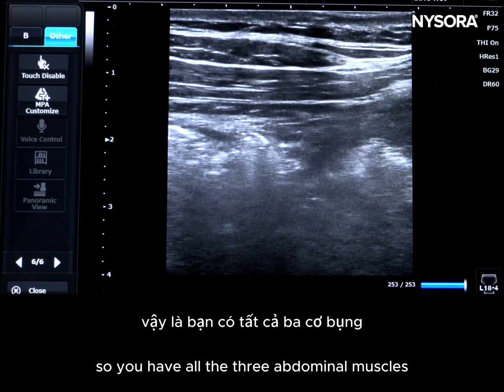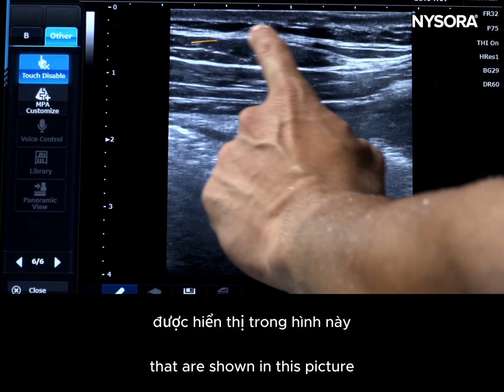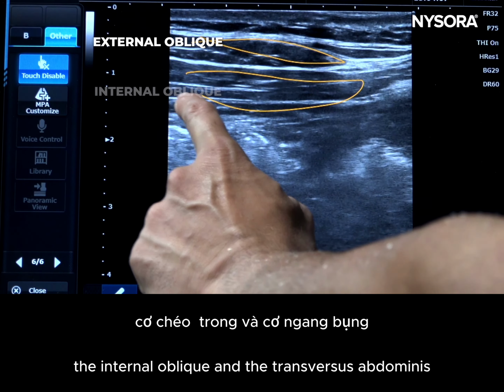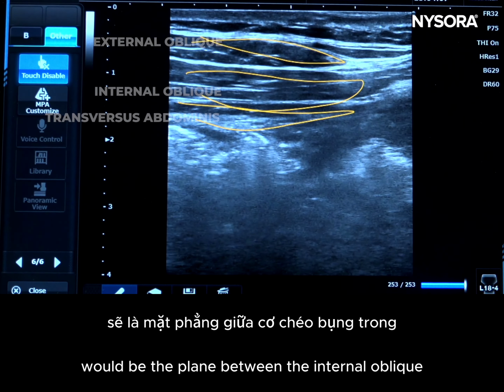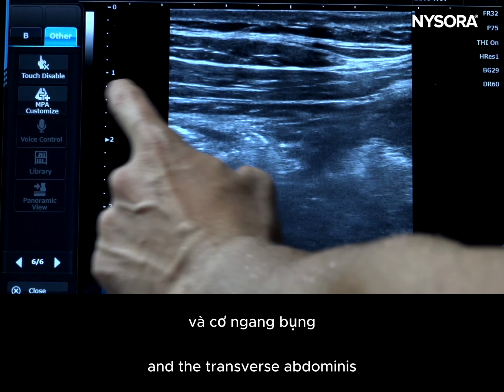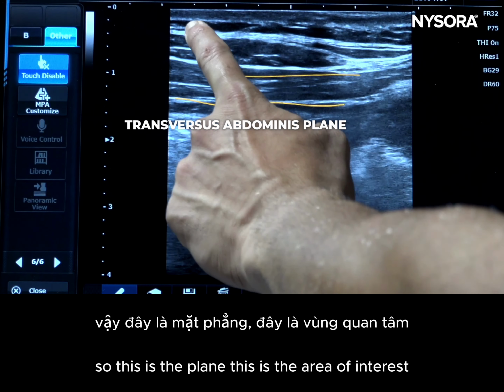So you have all three abdominal muscles shown in this picture: external oblique, the thicker internal oblique, and the transverse abdominis. And the TAP plane would be the plane between the internal oblique and the transverse abdominis. So this is the plane, this is the area of interest.